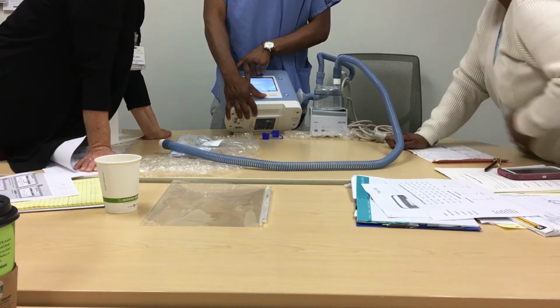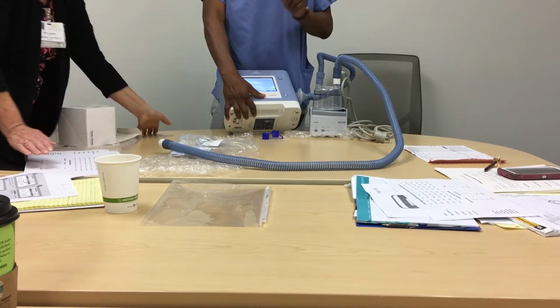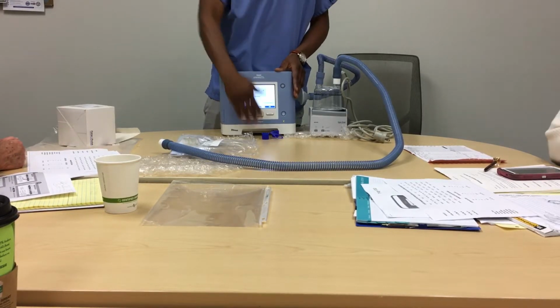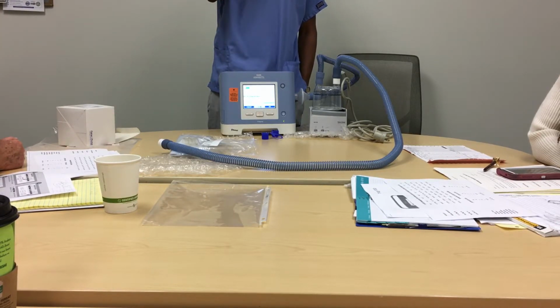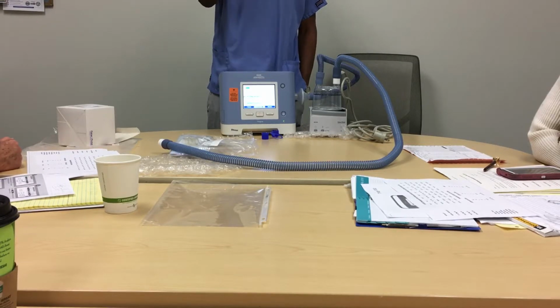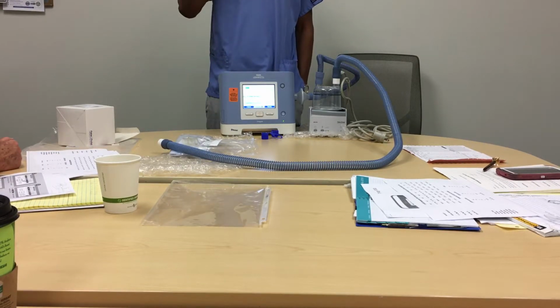Yeah. There is a patient we are working with right now, and he's on the SIMV. We noticed that the apnea rate is set to, I will just say, 10. I don't know why, but the sensitivity was initially set to 2. Every time he would ride the vent, it would alarm all the time. We tried increasing the rate, it did not help. Tried increasing the apnea rate, it did not help. In the end, we had to increase the sensitivity. Yeah, because you dialed them out. Correct. And at least it helped.